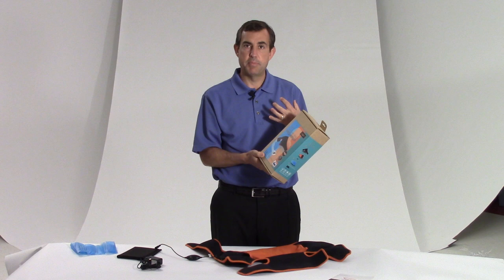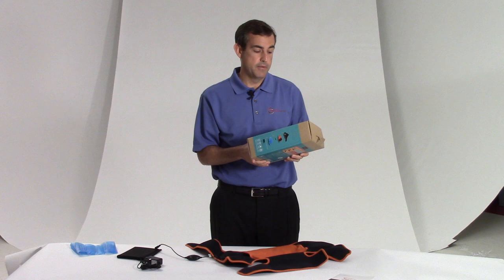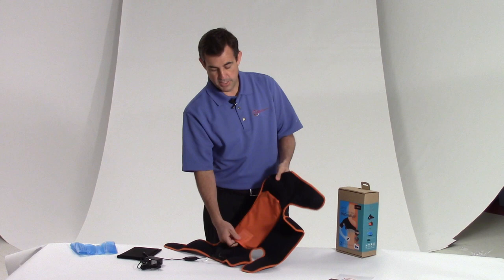Let me show you what comes in the box and how to use it real quickly, and then you'll be on your way to some relief. You have the wrap itself, which is in front of me, and the wrap includes inside this mesh a heating pad. It's not an old heating pad — this is an infrared technology heating pad, which is going to go deeper and provide better blood circulation and muscle relaxation.